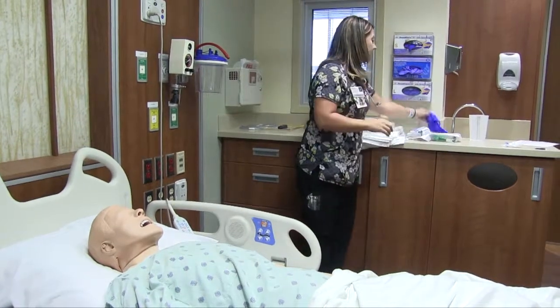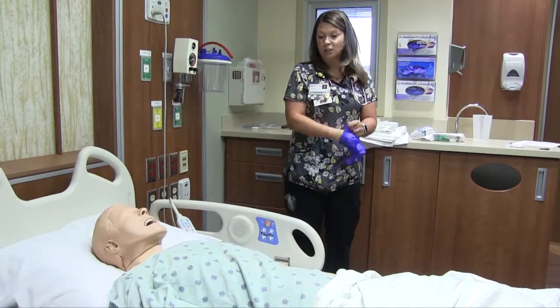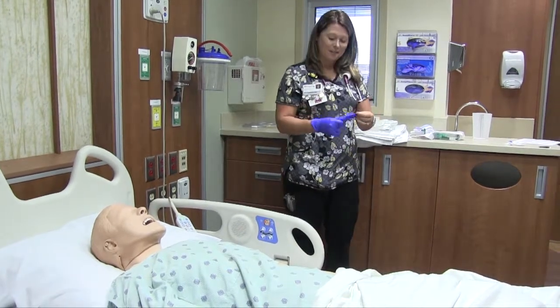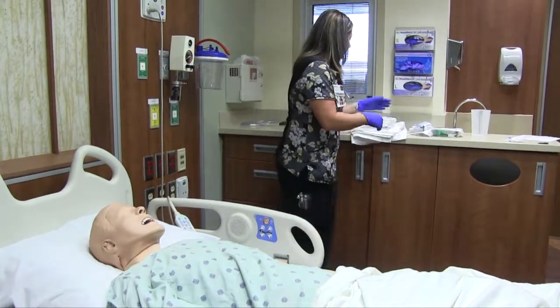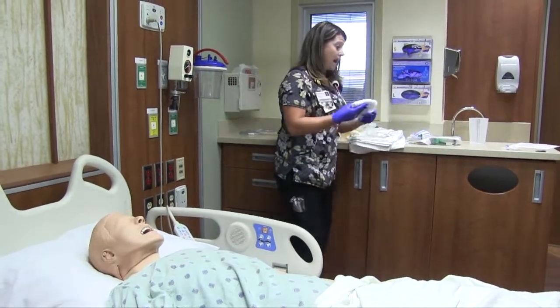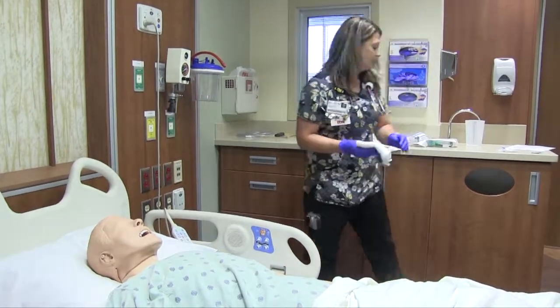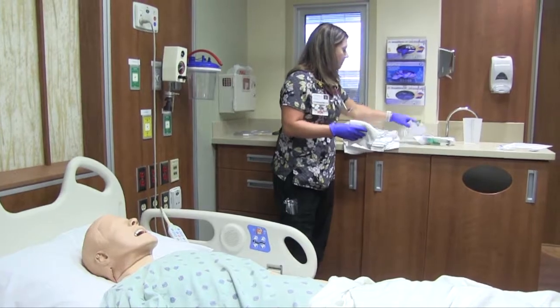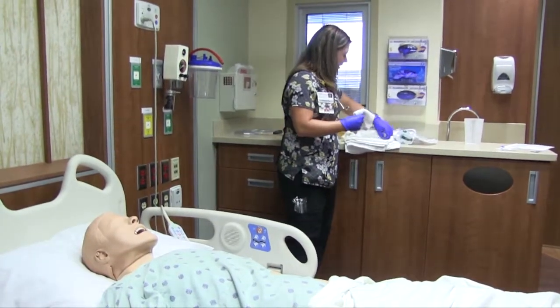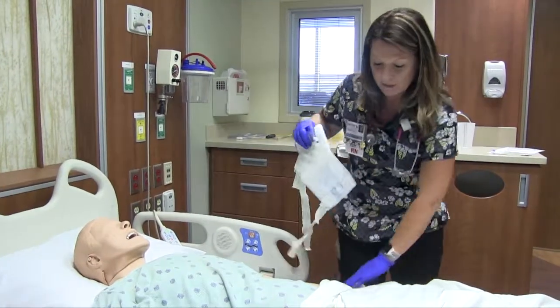And wash and dry your hands. I'm going to apply gloves today. At home you don't need to do this, but since I'm here, I'm going to do it for you today. I generally grab a washcloth. You're going to need alcohol wipes, and then whichever system that you're going to trade over to. So today I'm going to switch it to the leg bag since we're going home and show you how to do that.